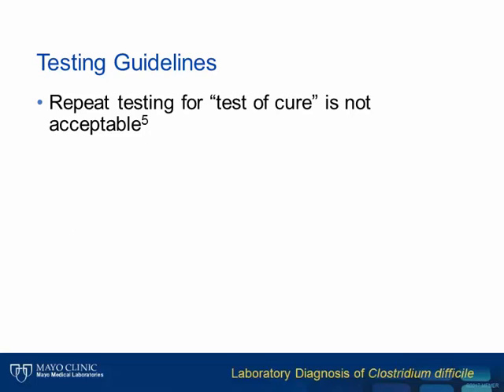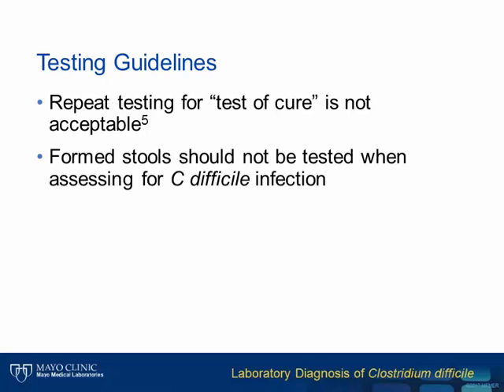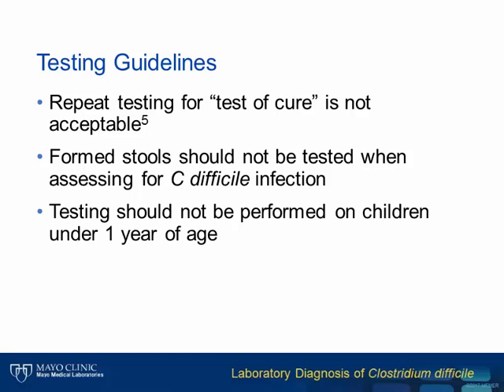We'll wrap up this talk with general testing guidelines. Repeat testing for use as a test of cure is not acceptable. Toxins can be detected in stool as long as 30 days after resolution of symptoms. Formed stools should not be tested when assessing for C. difficile infection. Testing should not be performed on children under 1 year of age.